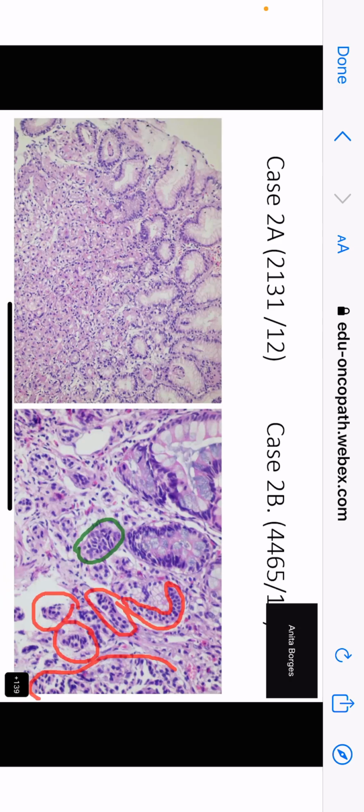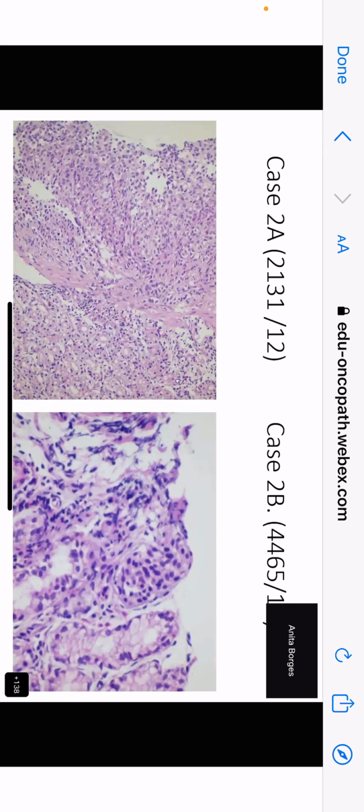On the other hand, this is sitting right in the lamina propria, along with lots of, do you see the eosinophils? Yes, ma'am. There are plenty of eosinophils over here, and on the left hand side here you can see absolutely normal fundic body type gastric mucosa. There's nothing wrong with the body mucosa or the mucosa on the left hand side. Okay.